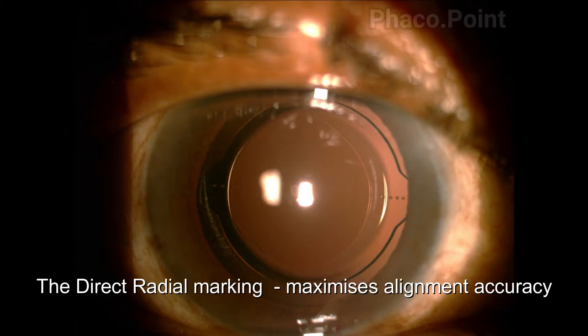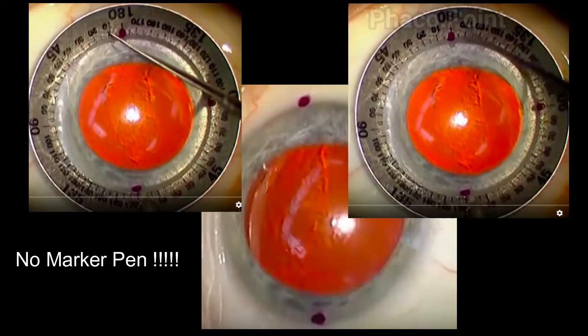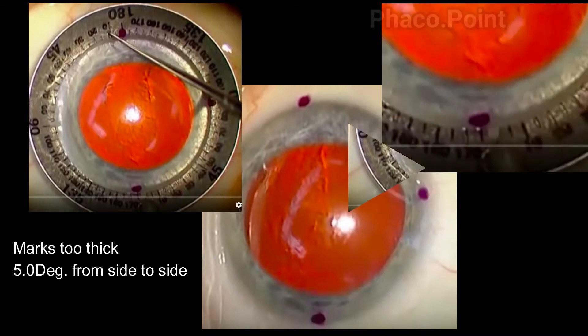In the new marking technique I changed two things. Firstly, I did away with the marker pens because I feel that these marker pens leave behind marks that are too thick. When I actually took a close look at the thickness of these marks, I found them to be at least five degrees thick, as you can see from the graduated scale of the Mendez axis marker.